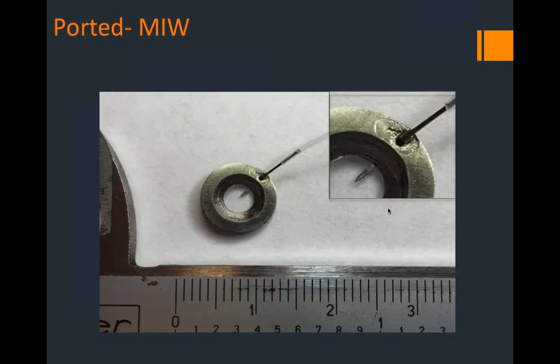What that means is we developed something called a ported mammary imaging window, which is essentially what we did is we took a 30 gauge needle and fed it through the side of the mammary imaging window, which gave us a port underneath that allows us to now introduce different dyes or stains, and in this case, primary conjugated antibodies, in order to look at the environment.